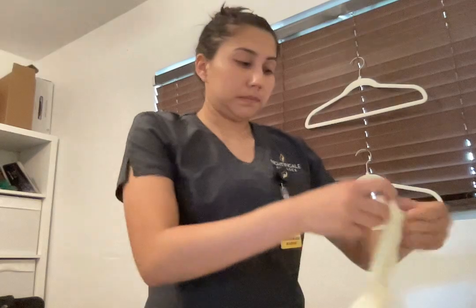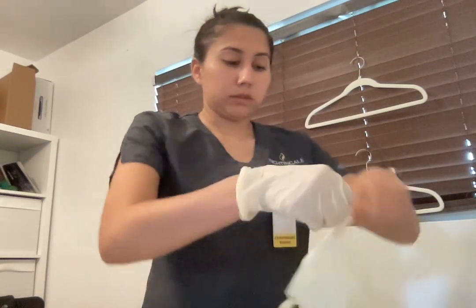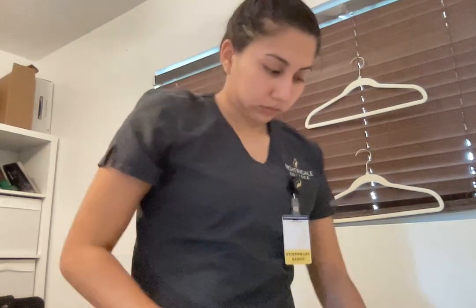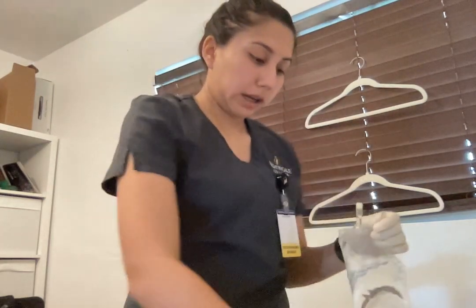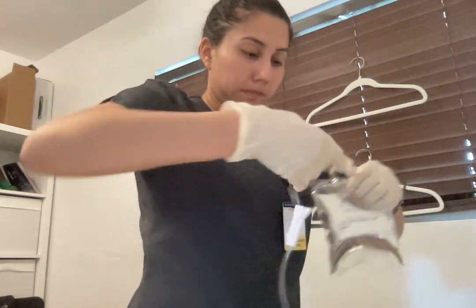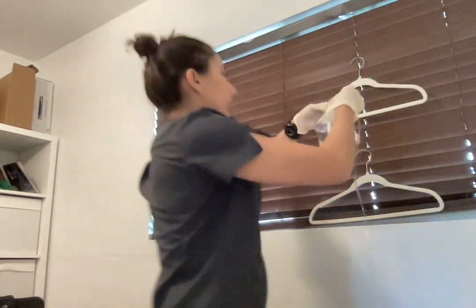So I would do hand hygiene, put my gloves on, and explain to the patient what I'm doing for their IV medication and fluid. Alrighty. Remove this blue tab right here and my spike. Make sure it's sterile. Poke at it. Okay, making sure my clamp is all the way down.